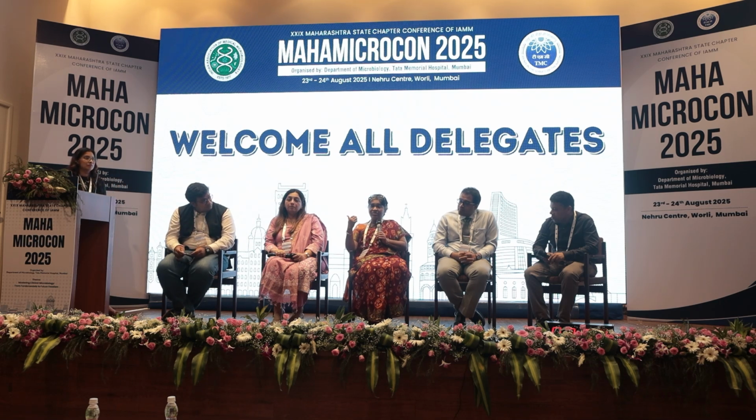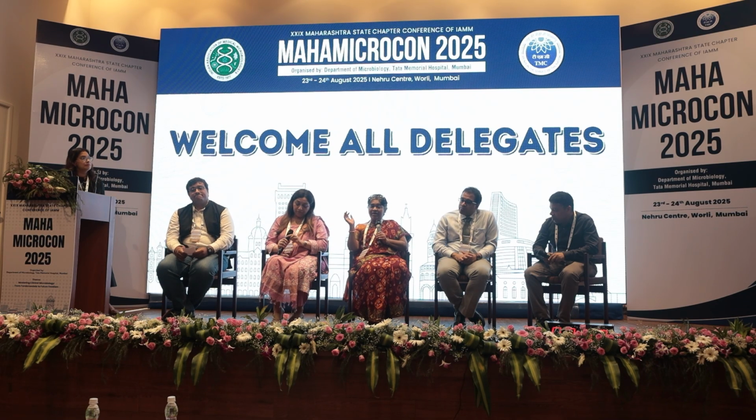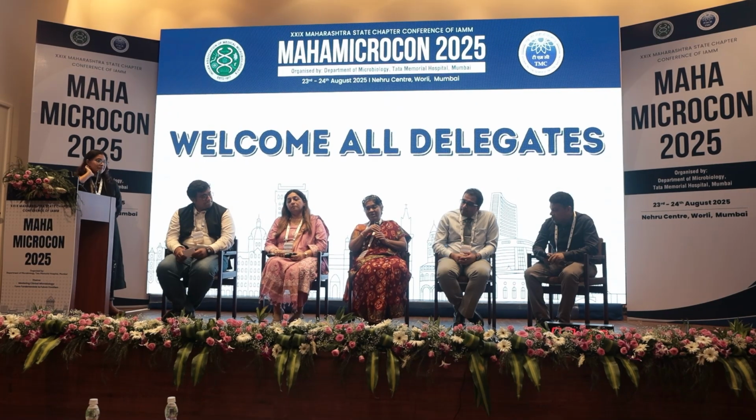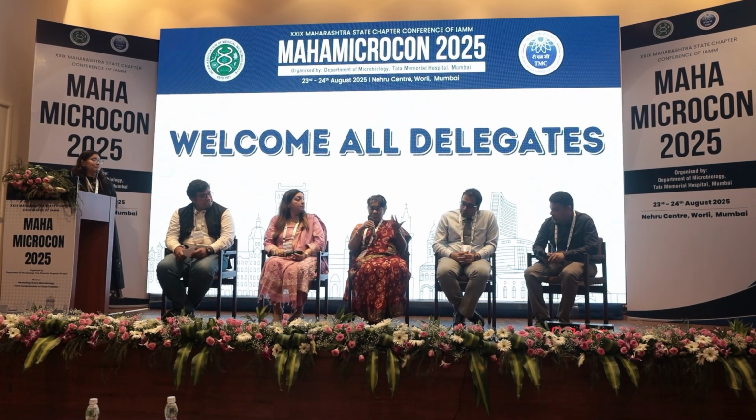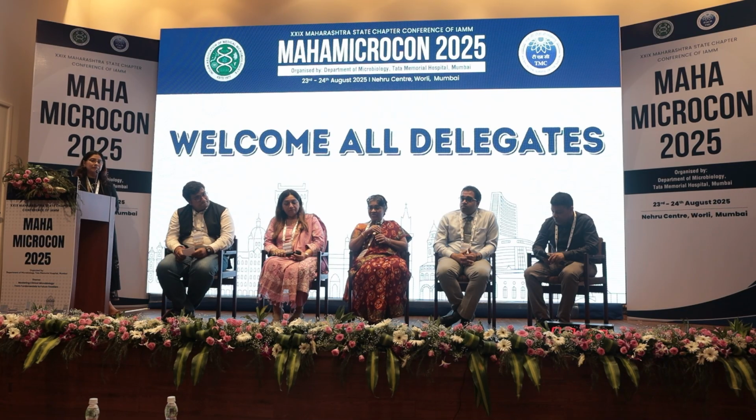Another thing we did was, Mahua offered to do the WGS of stools because there had to be a source for this Helicobacter cinaedi. And we found Helicobacter cinaedi in her stool sample also. That was another very interesting thing we observed, something we wouldn't have been able to find, in fact, Maldi-TOF as well as Vitek misidentified it as Campylobacter coli. So this is definitely an interesting technology, and what I'm excited about is that results come in 24 hours directly from the sample. That is what is really exciting.